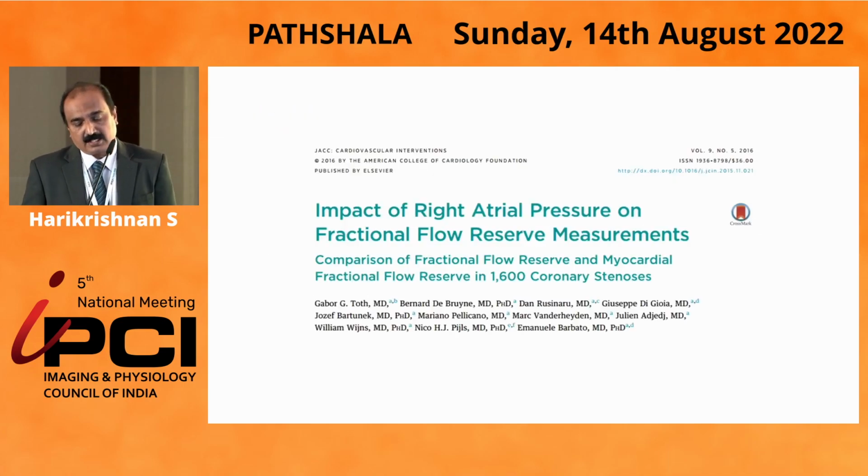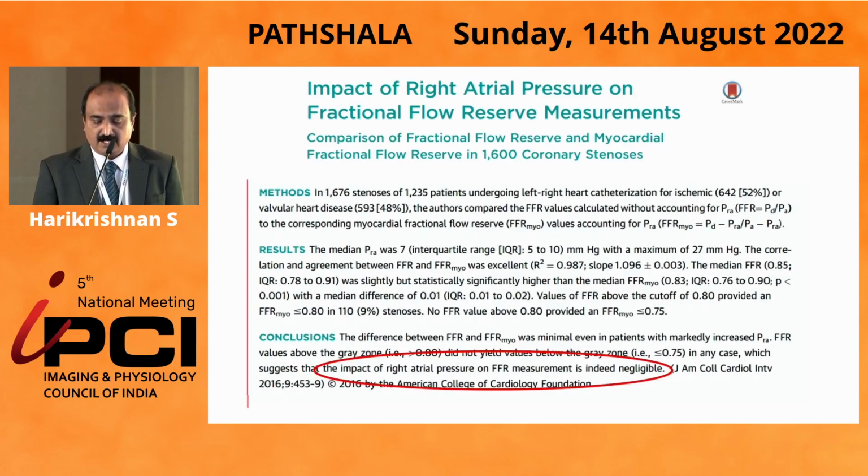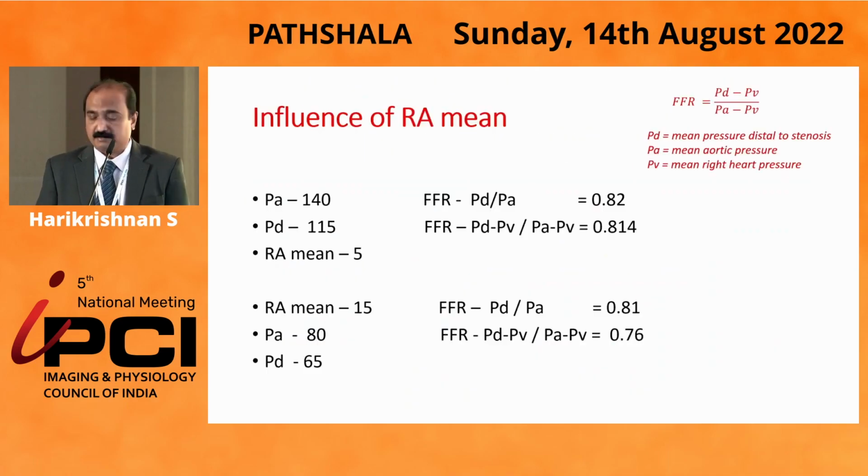Then another aspect is the impact of right atrial pressure on fractional flow measurements, because right atrial pressure, in a usual situation, is indeed found negligible for FFR. So I will show you an example of the influence of right atrial mean on this pressure.